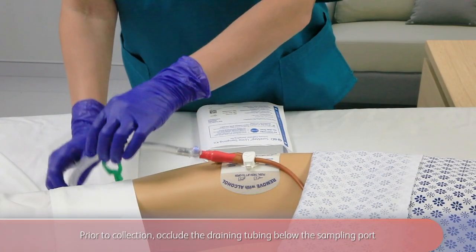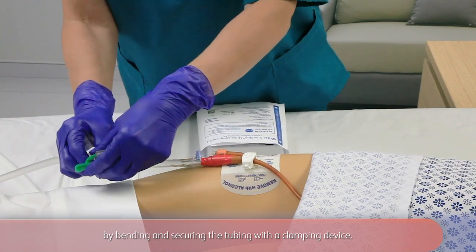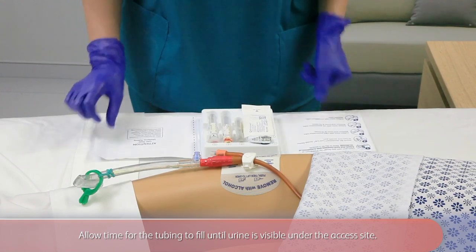Prior to collection, occlude the draining tubing below the sampling port by bending and securing the tubing with a clamping device. Allow time for the tubing to fill until urine is visible under the access site.